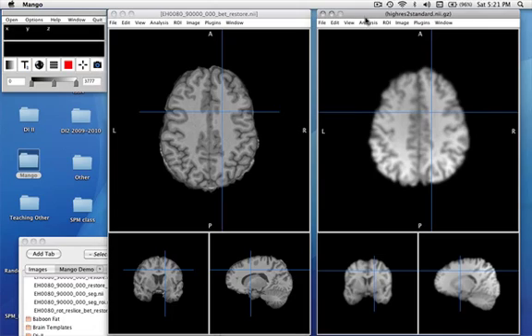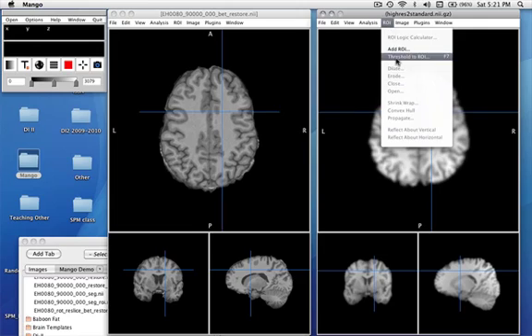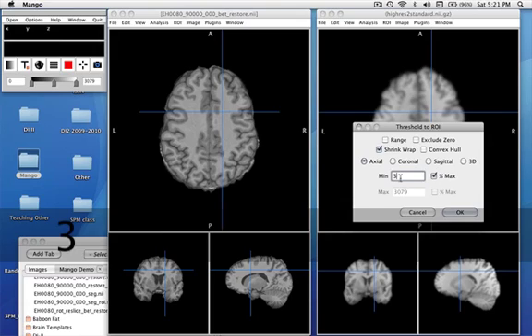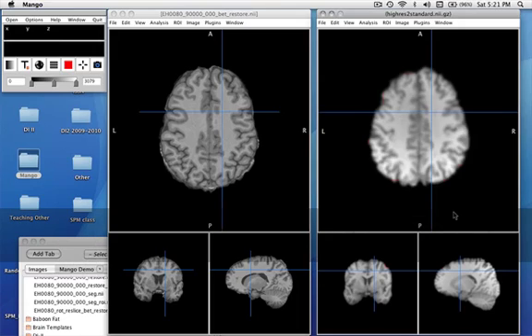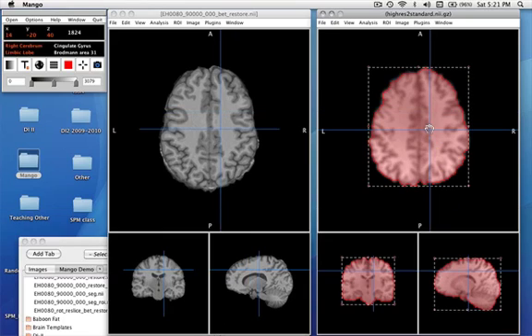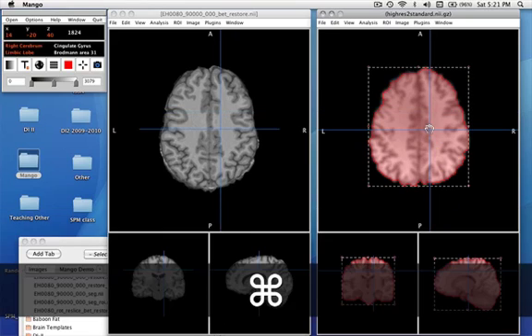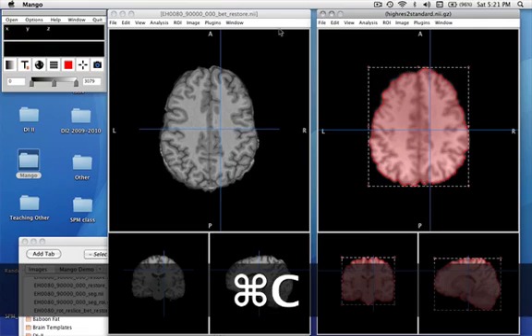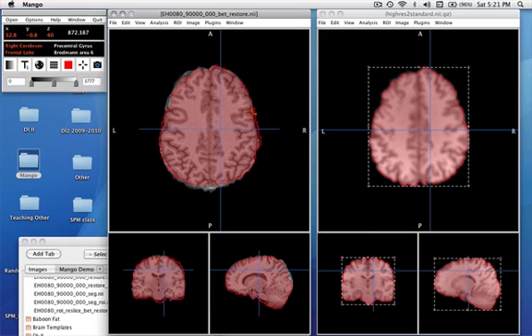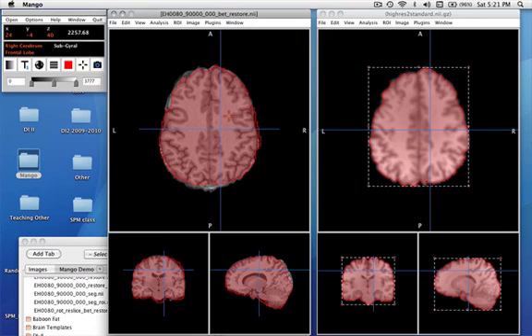In a similar fashion, we create a region of interest over here. We might do this with a shrink wrap to something like 30 percent of the maximum. Just a good outline picture. We can copy from that region. Again, now low resolution to high resolution. So interestingly, these are different brains, both registered to the Talairach standard, and they overlap reasonably well.